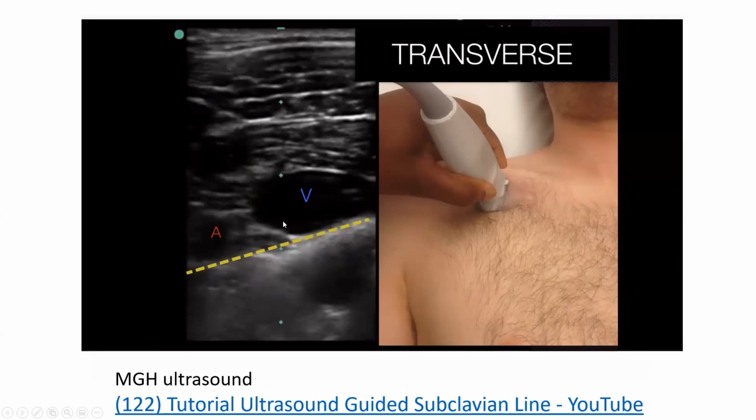That's another advantage of axillary artery versus subclavian. You cannot see the subclavian by ultrasound because it is inside the chest. Now, how do you distinguish artery from vein? Artery is pulsatile, whereas the vein is not pulsatile and it's compressible. But those rules are not always true.